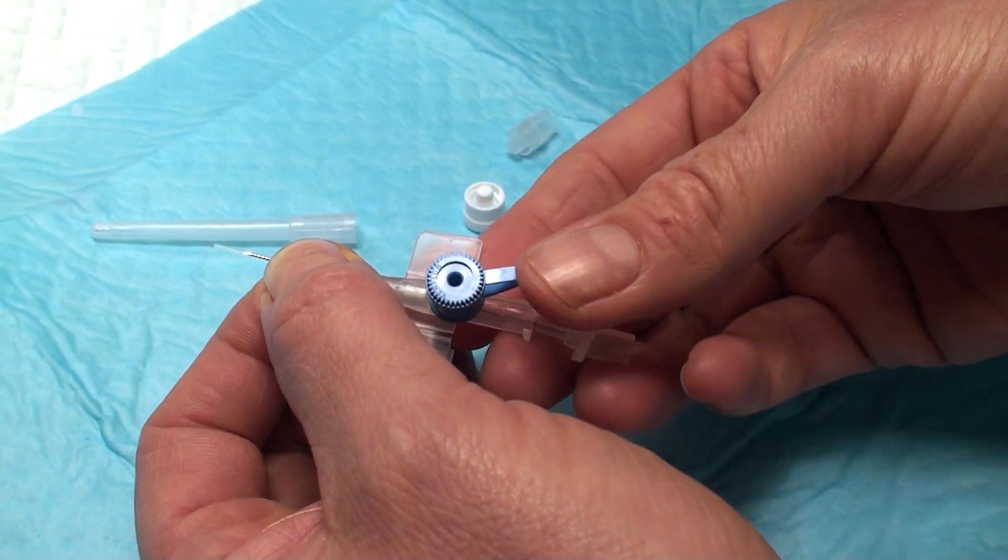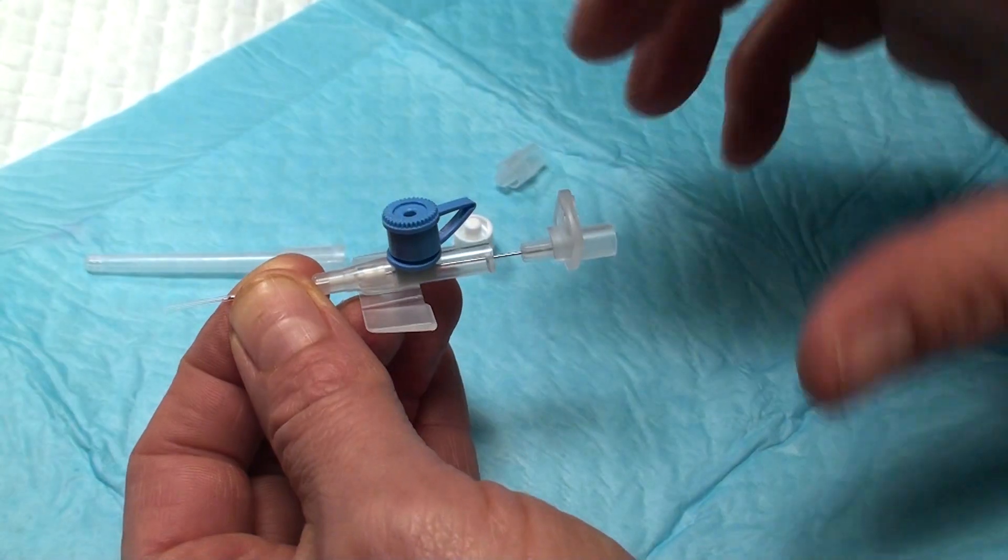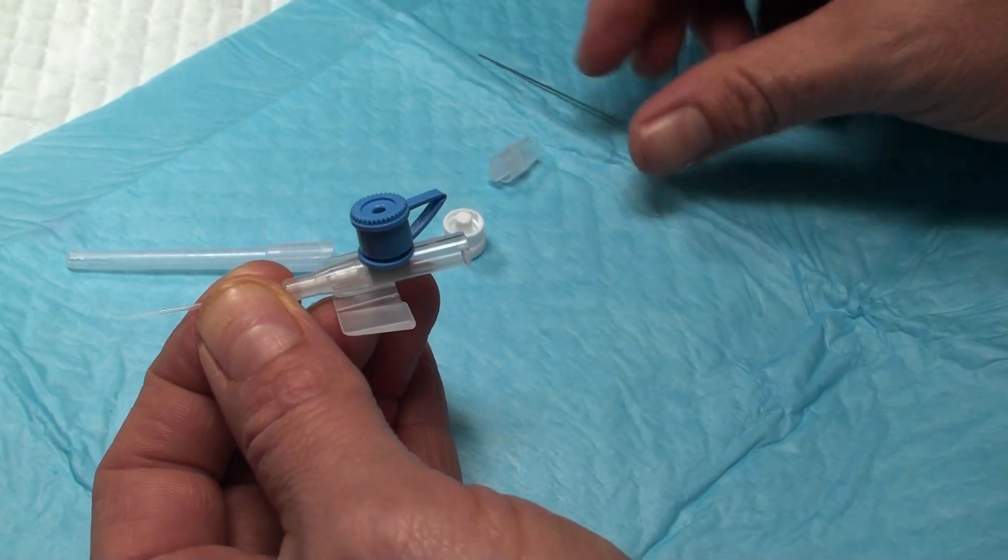Then you just go on like this until you have the entire catheter inside the tail of the animal, and then you remove the needle.